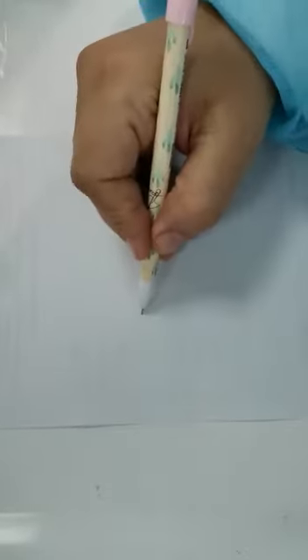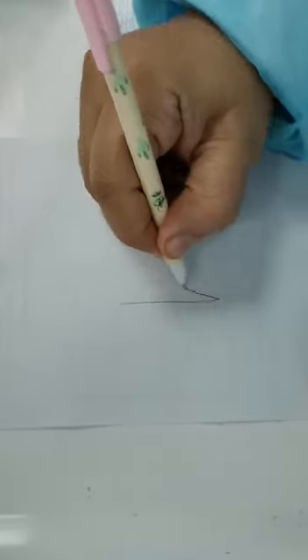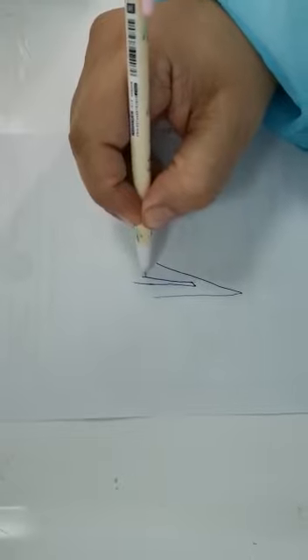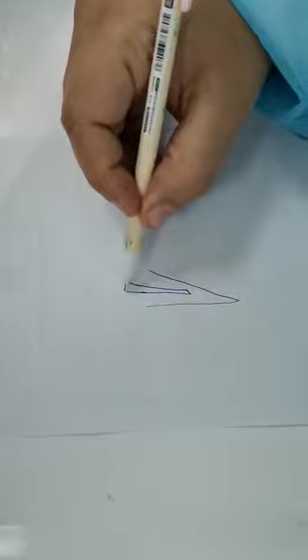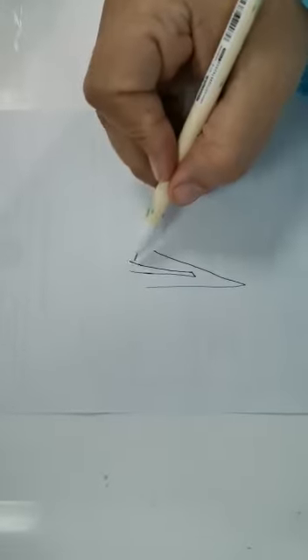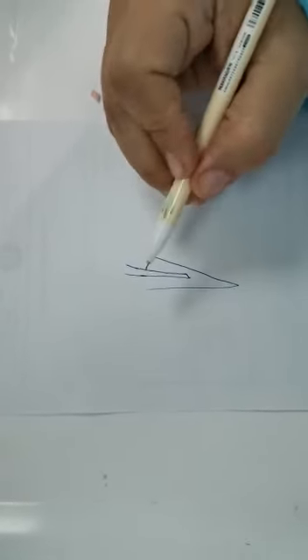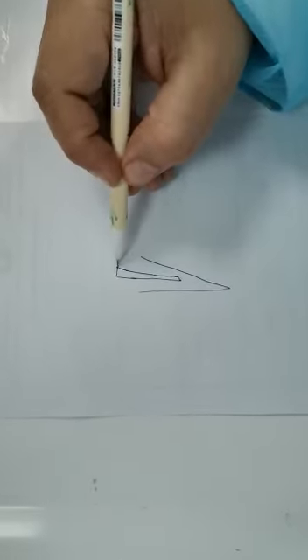First of all, what is the type of the post that you have inside the tooth? Fiber post. What is the main indication for a fiber post? Retention. But also as an aesthetic material. So it's whitish, so many times we choose it for the color. That problem of the color will also be a problem when we remove it, because we could not identify the post area from the adjacent tooth structure sometimes. It's very difficult. So how am I going to remove a post that has fractured?